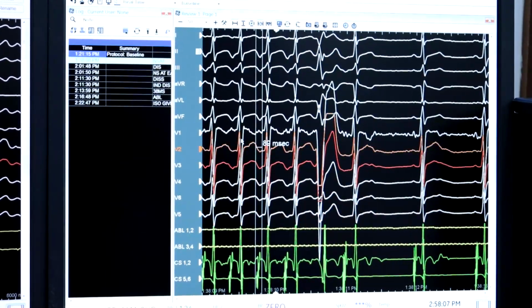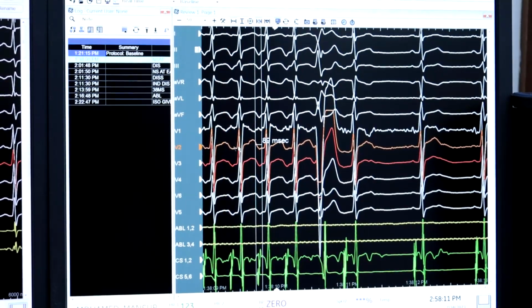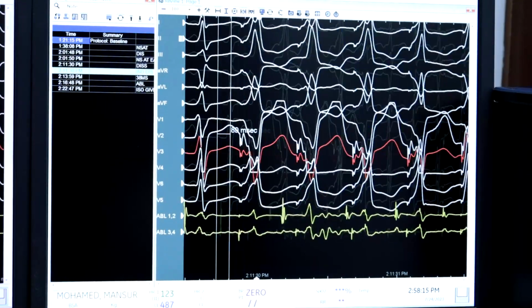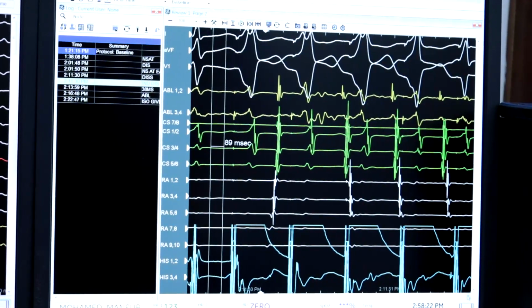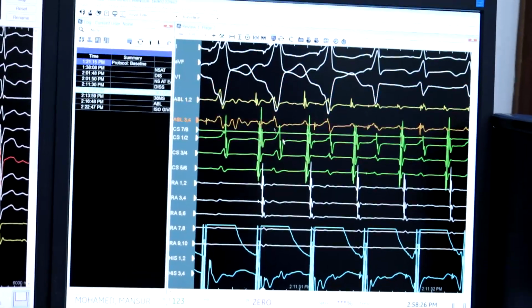And this is the tachycardia ECG, and this is our P wave. Here also, during the tachycardia and during the induction, we had VA dissociation at the beginning. This is a very good example that the tachycardia is running. Stay here, Ahmed. And we are doing V pacing.